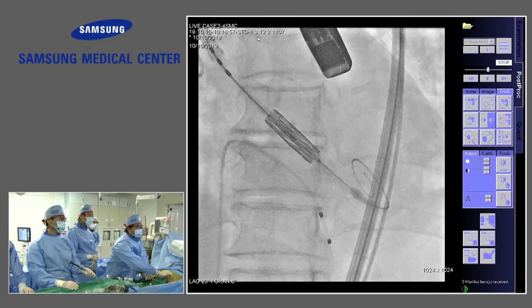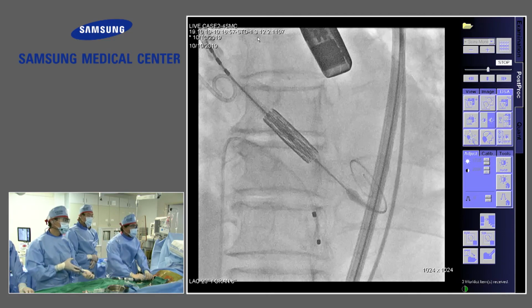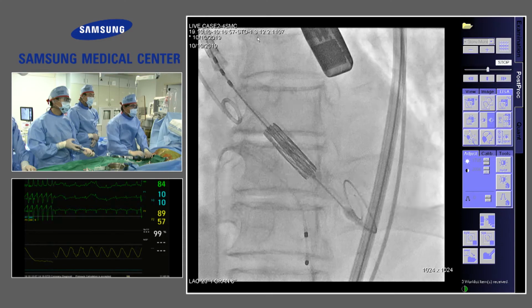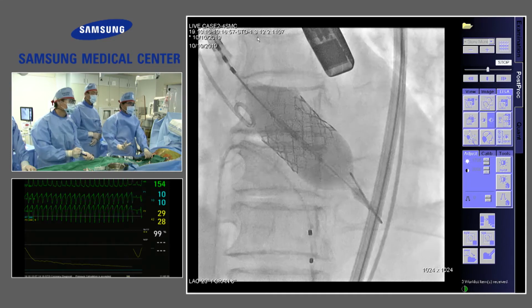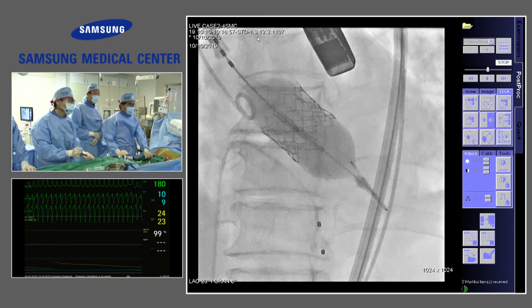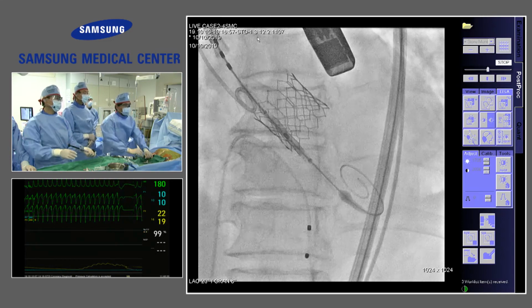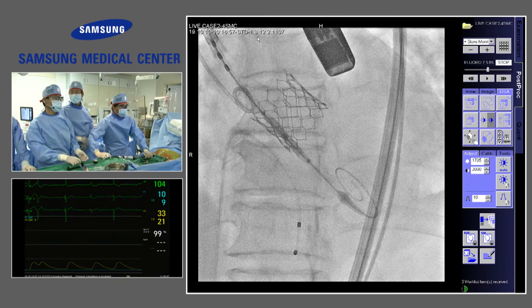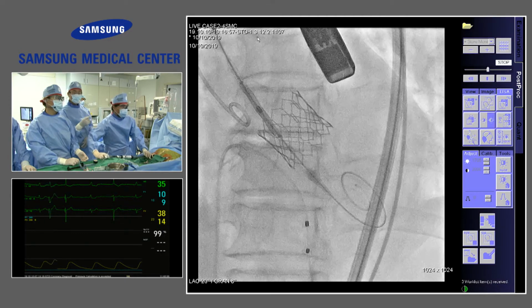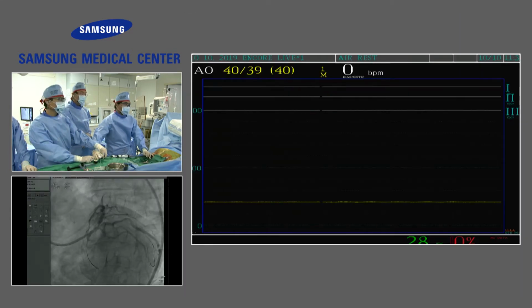Okay, yeah. Pacemaker ready? Pacemaker on. Okay, inflation slowly. 2. Okay, firmly. 1, 2, 3, notice you didn't do 4, 5. Okay. Inflation. Pacemaker. Pacing. Pacing 60. Please show the pressure. Pressure. Over there, the camera. Yeah, pressure is coming back.